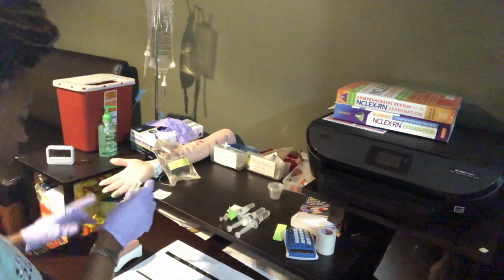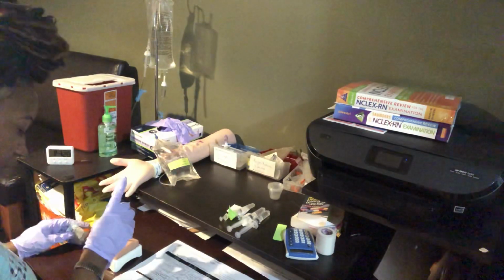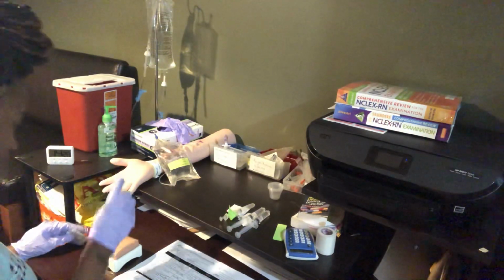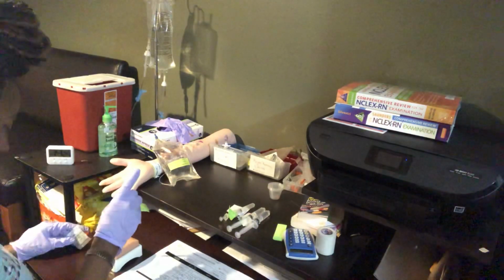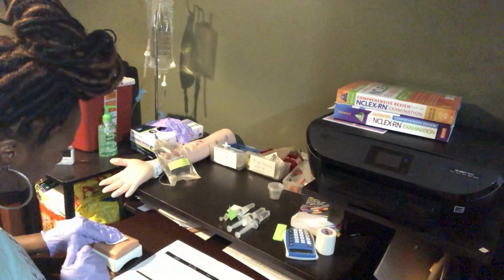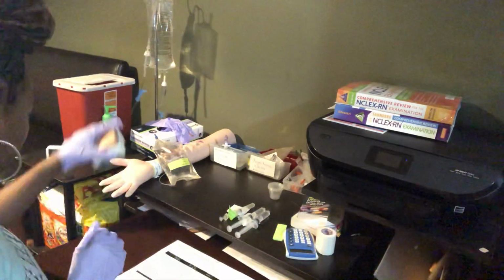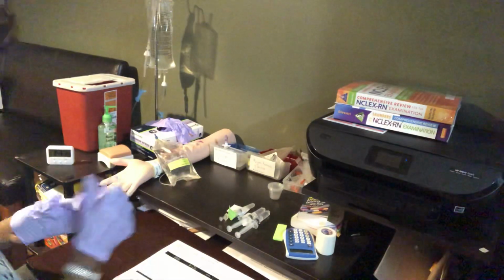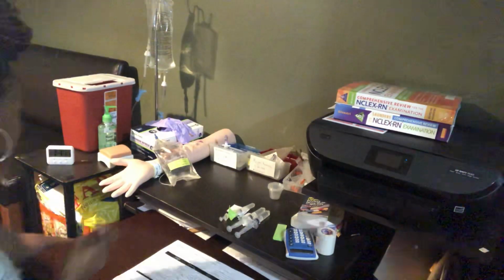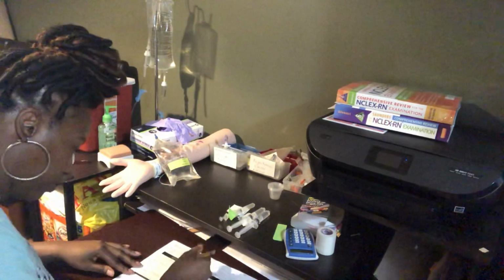I should have kept that. I'm giving this in the right upper quad. Okay. Put it in the sharps container. Add pressure. Okay. Done with that. Clean my hands. I gave the insulin.